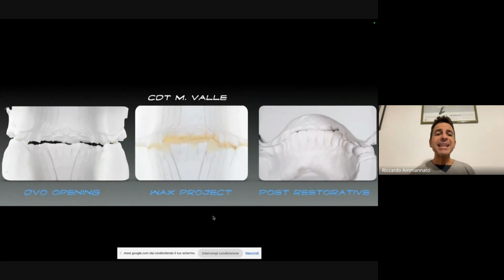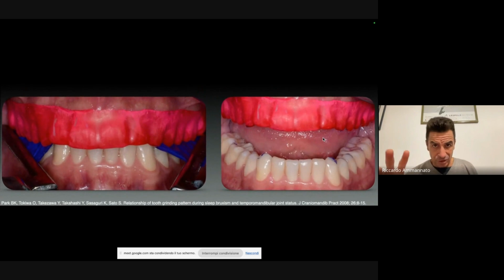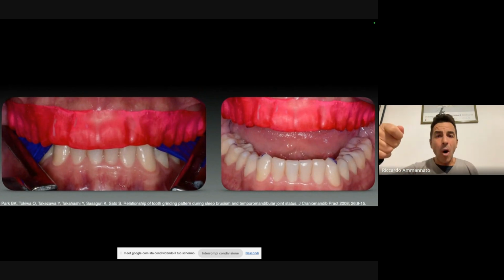So, this was the initial situation of the case, this was the project, and these are the two alginates that I took after that video that you have seen, after the occlusal adjustments, after the polishing of everything. Because on these two models, I'm going to do two things. The technician is going to deliver to the clinic a night guard to deliver to the patient first, and then I'm going to deliver another Brax checker, okay? A post-op Brax checker. We did the diagnostic one before, and now I'm going to deliver a post-op.